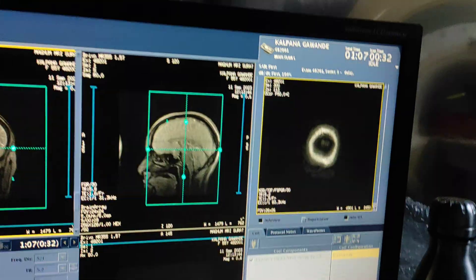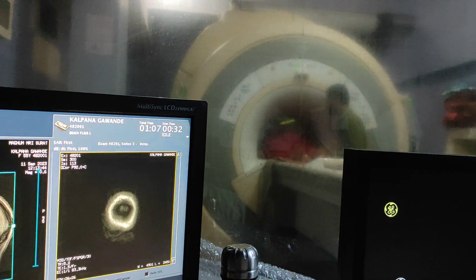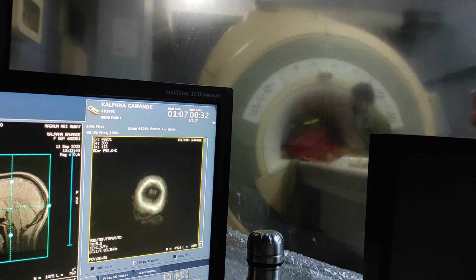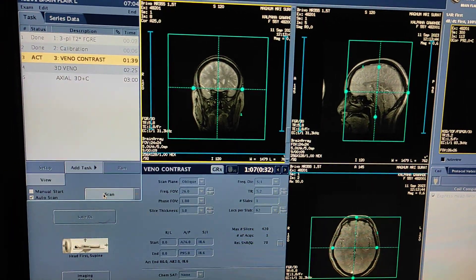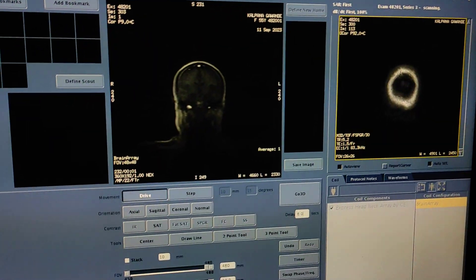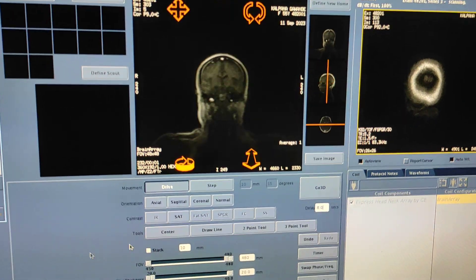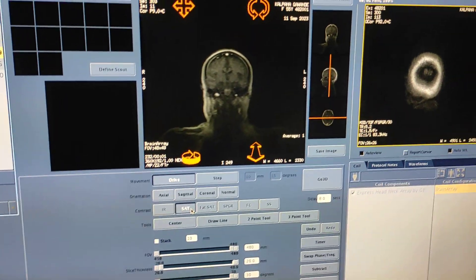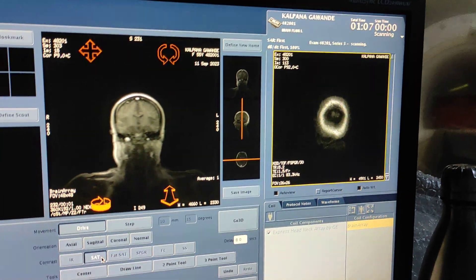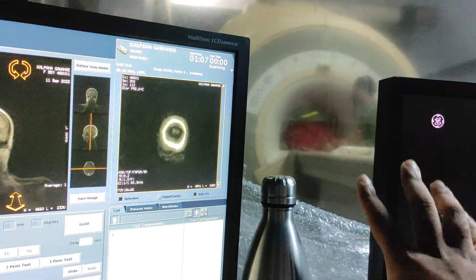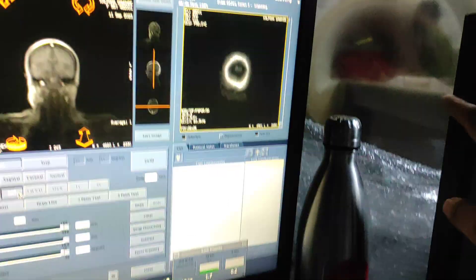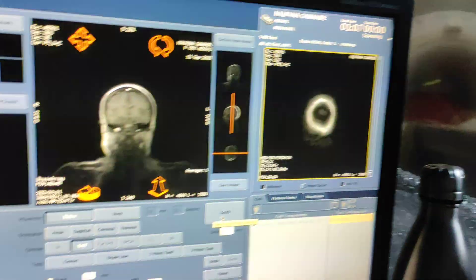This is now the prep scan. Two phases will come after giving contrast. You have to ask the anesthetist doctor to push the contrast. As soon as he starts pushing contrast, you have to start the scan. Now I will show you — this interface will open. You have to click on 'set back.' Everything is ready; you can see the timing is zero at present. Ask the doctor to start contrast, and as soon as he starts, you click 'Go 3D.'